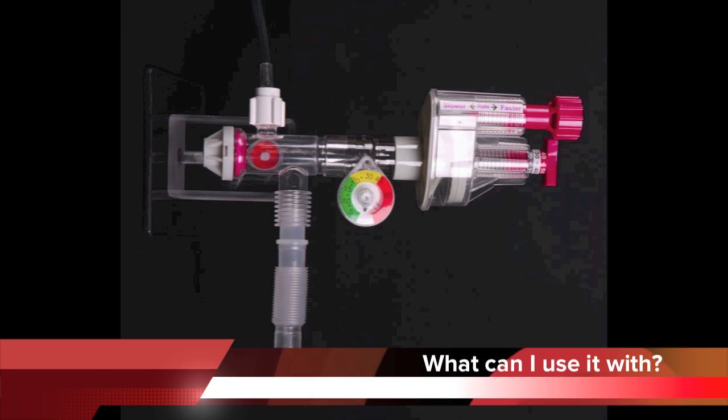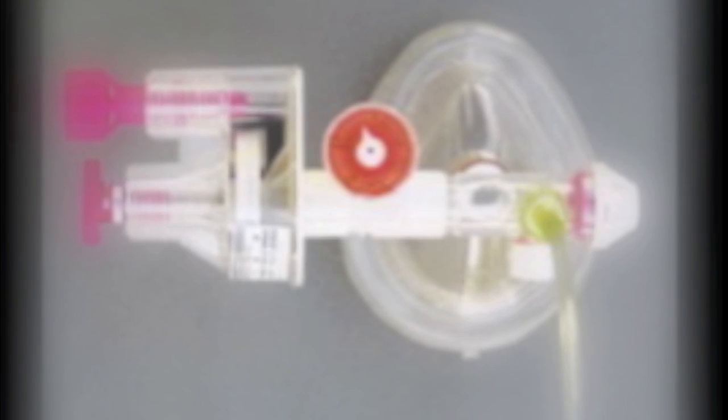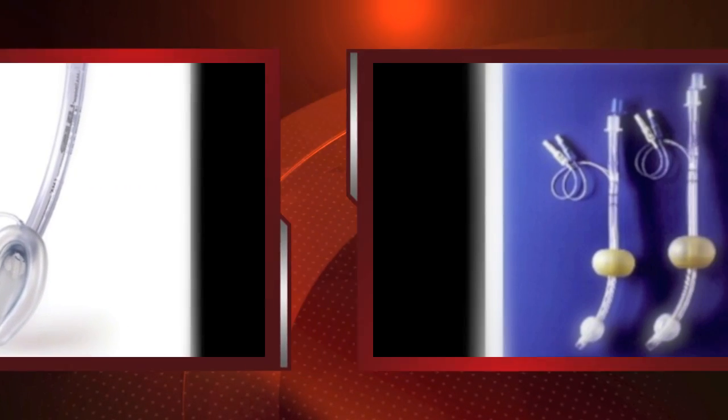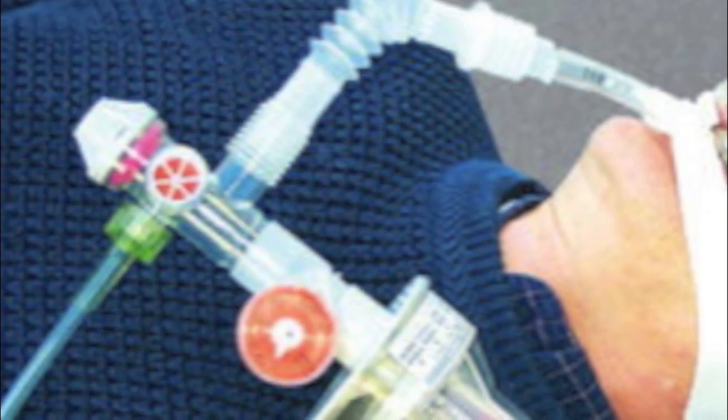So what kind of advanced airway devices or basic airway devices can you use the Surevent with? You can use it with a mask. You can use it with an ET tube. You can use it with a King airway. You can use it with an LMA. You can use it with a combi tube and any advanced airway that makes a seal.